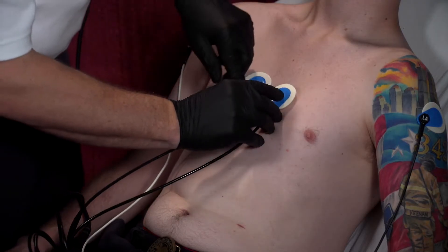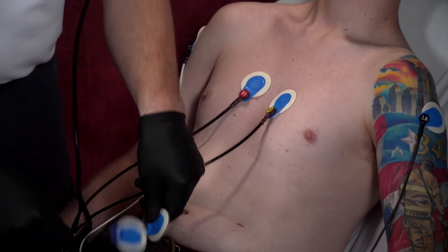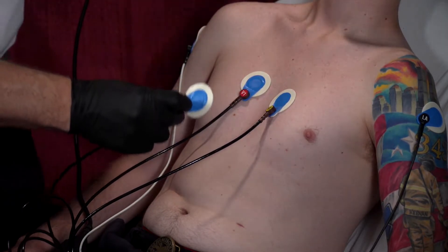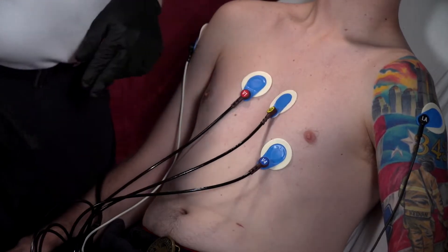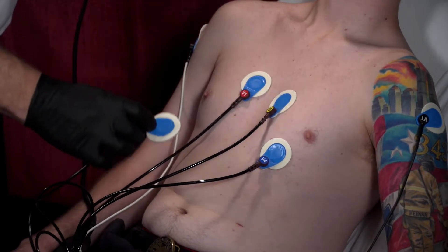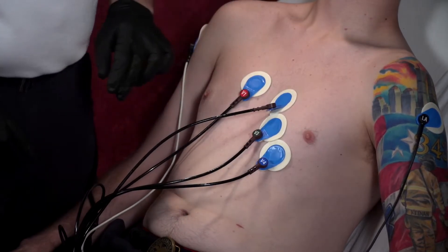V2 is going to go in that same fourth intercostal space. However, this is going to go on the patient's left side, parasternal. The next lead to place is V4. It's important to remember that V4 goes in the fifth intercostal space on the mid-clavicular line. We're going to place V4 at the mid-clavicular line in the fifth intercostal space, and then we're going to take V3 and put it right in the middle of those two.